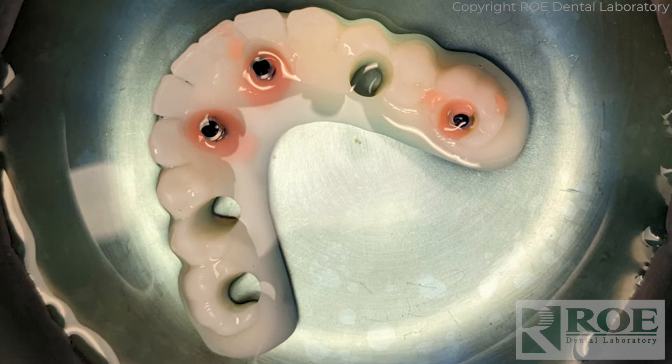The doctor placed all six implants and because torque was achieved on three of them, added the multi-unit abutments, then added the temp cylinders and seated the prosthetic on the carrier guide. The carrier guide is the only time this prosthetic can be seated during the whole chrome process — it must be on the carrier guide during surgery. With these three indexed, we can simply come back, screw them in, and pick up the three remaining implants, MUAs, and temp cylinders to index them.